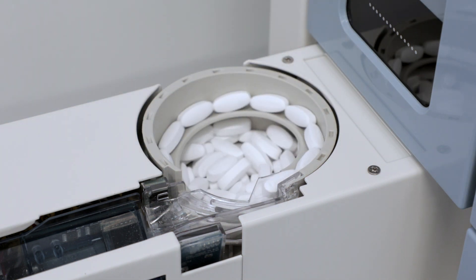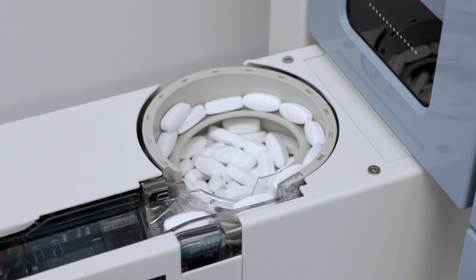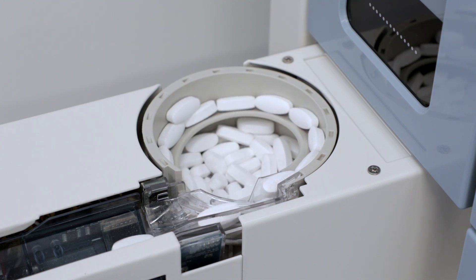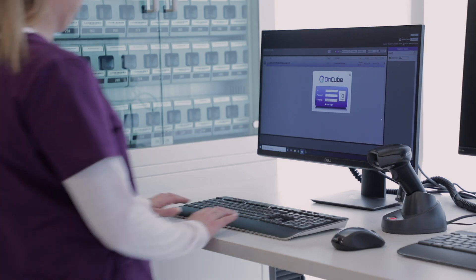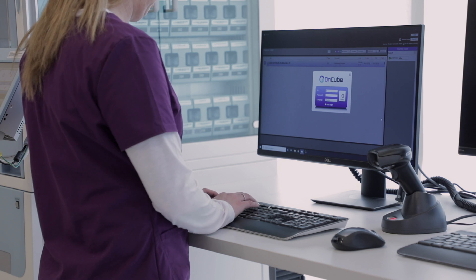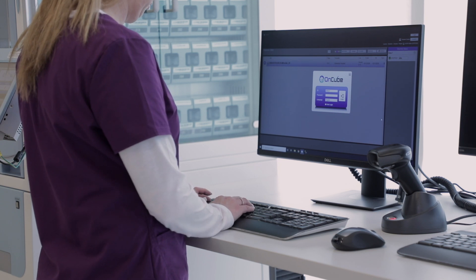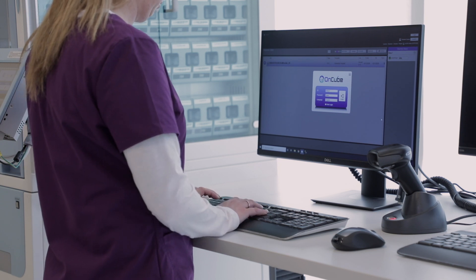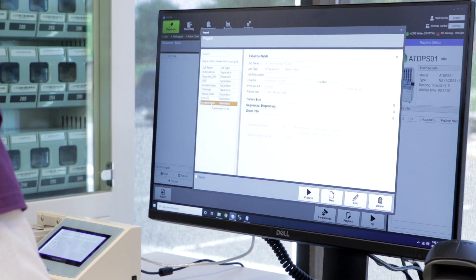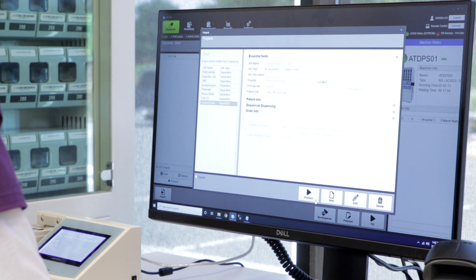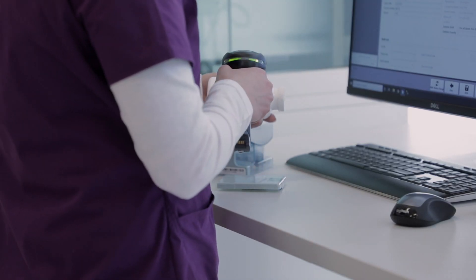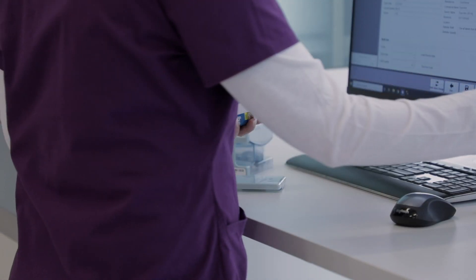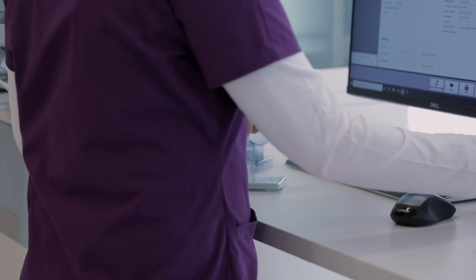Additionally, the pharmacy can complete packaging orders for medications not already stored in a regular canister, such as less frequently used tablets, half tablets, or special shaped tablets. To initiate the packing process, cabinet replenishment orders are sent to the AutoPak to be packaged. After an order is received that will utilize the AutoCanister, the user ensures that the correct medication is assigned.